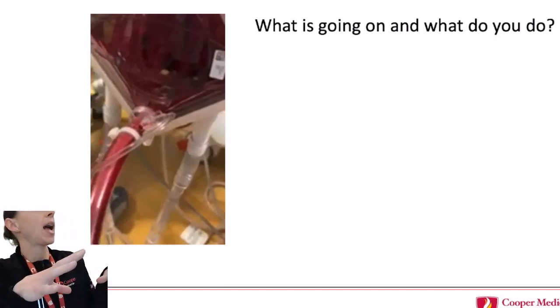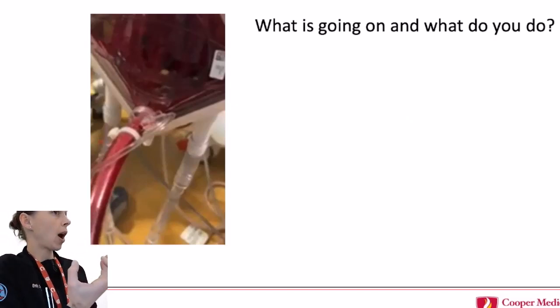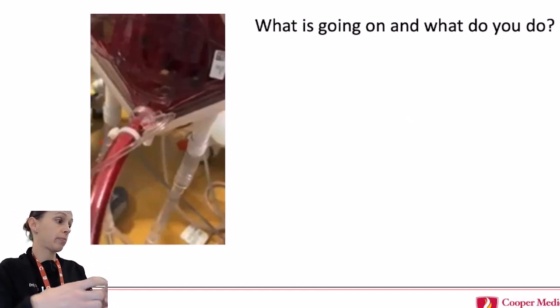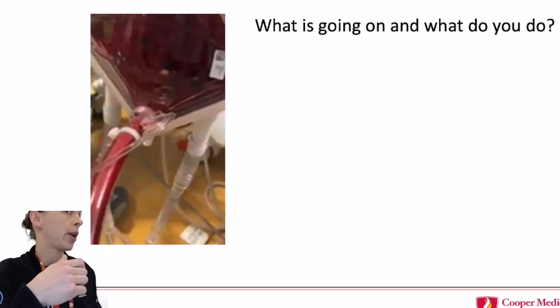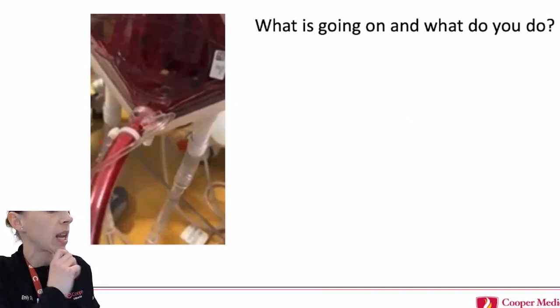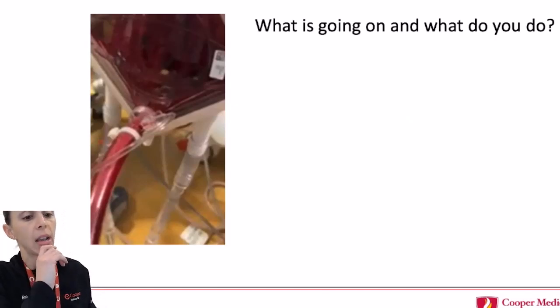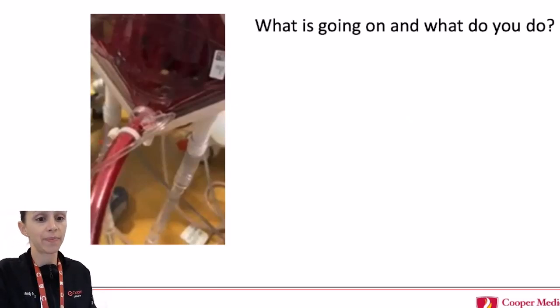So say you had loss of power or your battery died. If you didn't have a huge thrombus in the pump, with perfusion's help you can transfer that pump head and hand crank while you're preparing to do a circuit change. But yeah, I wasn't thinking through that you still have that thrombus. So in this case, you're clamping off and you have to do a circuit change. All the while, your patient is now dependent on their very sick lungs, so turn up the ventilator settings and try to oxygenate without the help of the circuit.